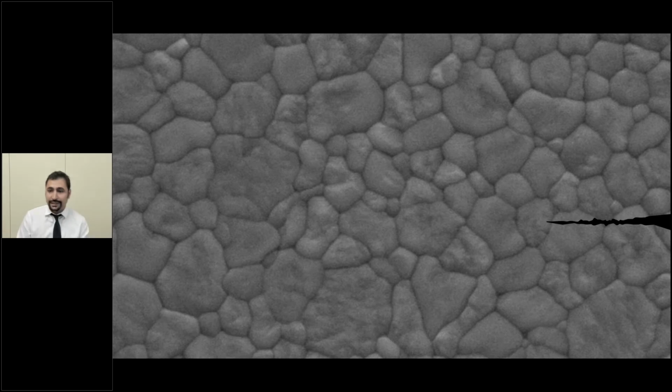propagate further down. Now, again, we know that 3Y zirconia has a higher amount of tetragonal phase, 5Y has a higher amount of cubic phase, and subsequently less tetragonal. So we can expect that 3Y has higher healing ability, if we call it that, than 5Y.